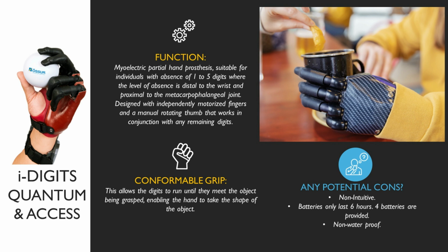So some patients have a better, higher EMG signal, so it would be turned down for them. If somebody had a lower EMG signal, then we would turn it up. That's all stuff that we would come and train the therapist with using this device and get them the program, so that way they could help with the training on this too.